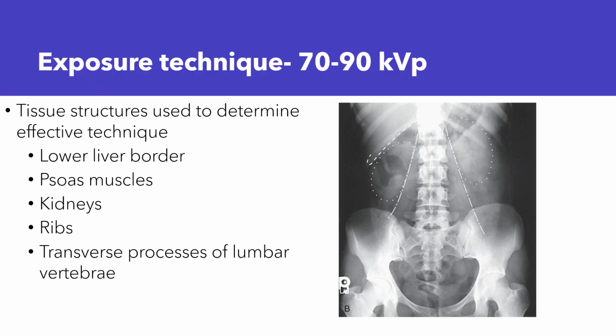The book recommends 85 for sthenic habitus. Now, what does that mean? Well, sthenic habitus means normal body habitus. So you're looking at an adult patient that weighs somewhere between 130 and 150 pounds. That's sthenic habitus. Okay. Average height, average build.